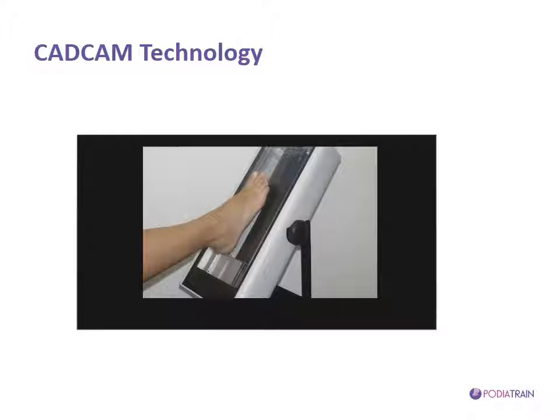CAD/CAM systems have a lot of important advantages. Mainly, they bring the orthotic workshop into our house or into our studios or into our clinics, because we are doing away with most of the materials and with most of the equipment that we normally use in the lab.